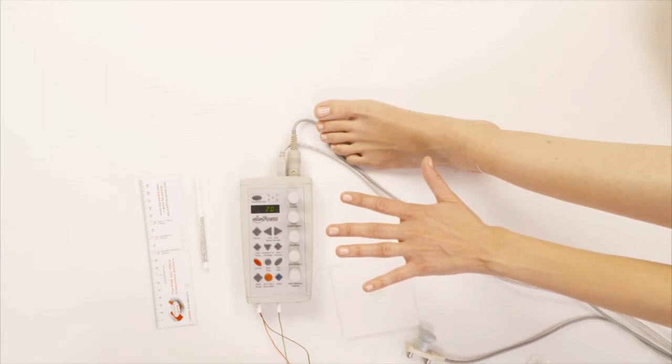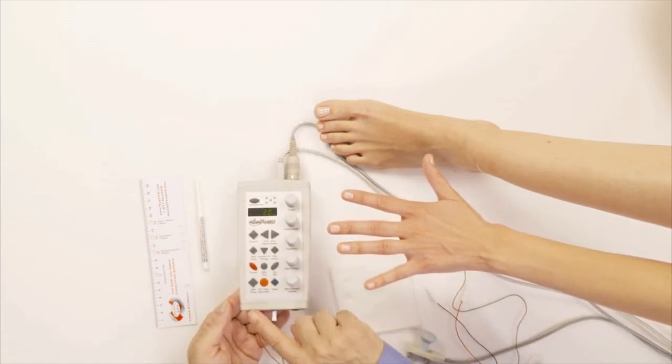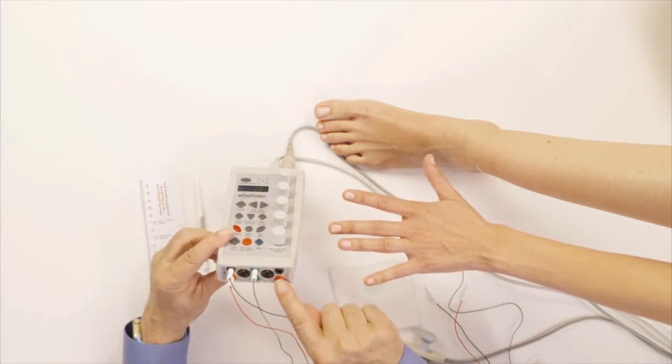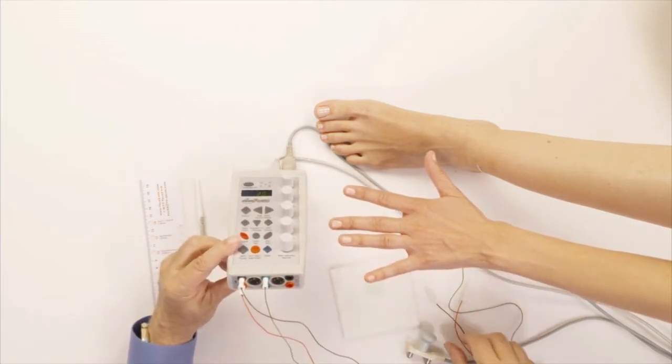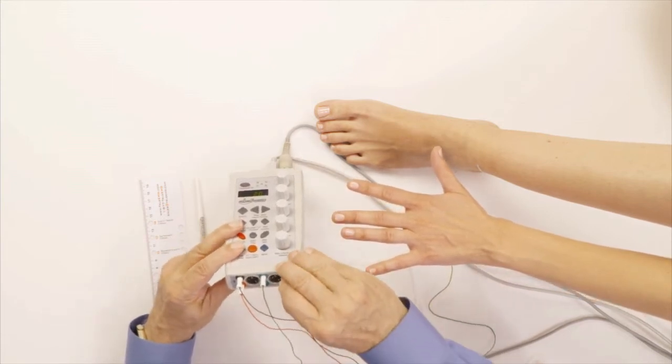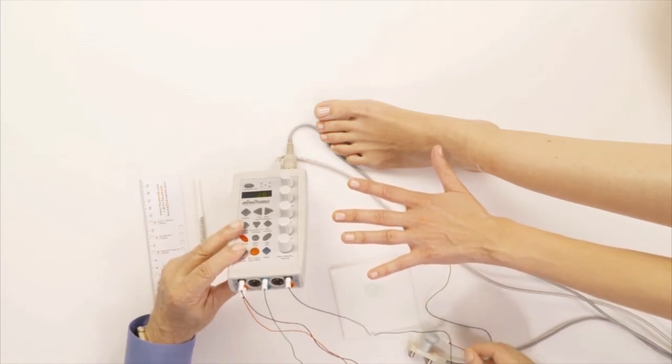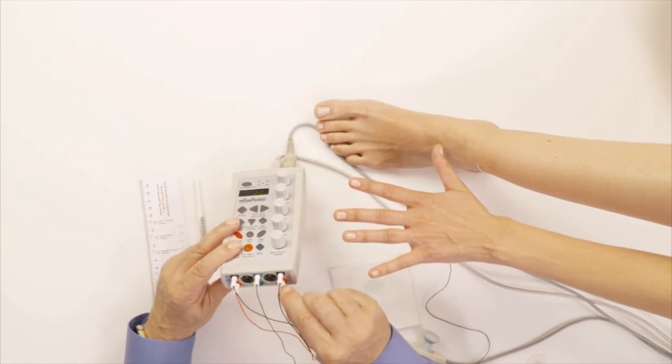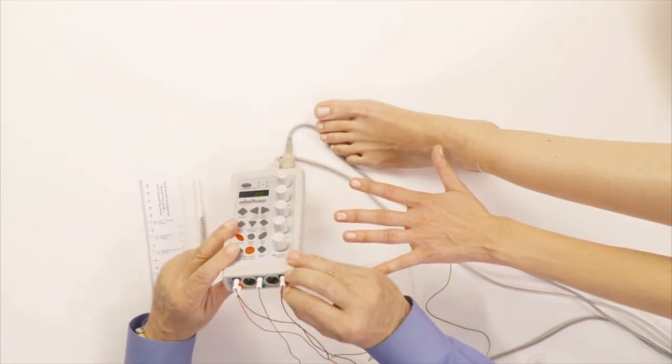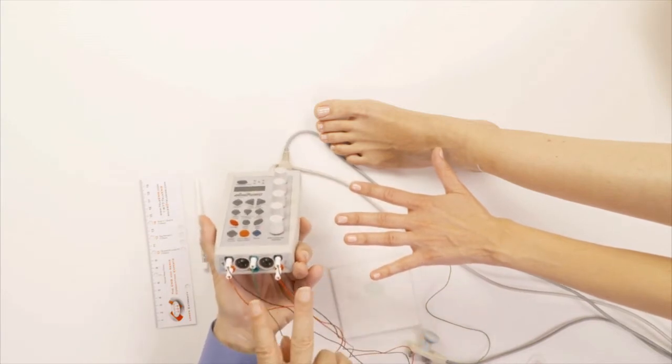The difference between these studies and the routine nerve conduction studies is we're going to use two channels. So we're going to put electrodes right here in channel one and also right here in channel two. In channel two, I only need to put the black electrode and also the red electrode. The green electrode is good enough for both sides at the same time. So this is the setup that we use for the galvanic skin response. You see both channels are now connected.